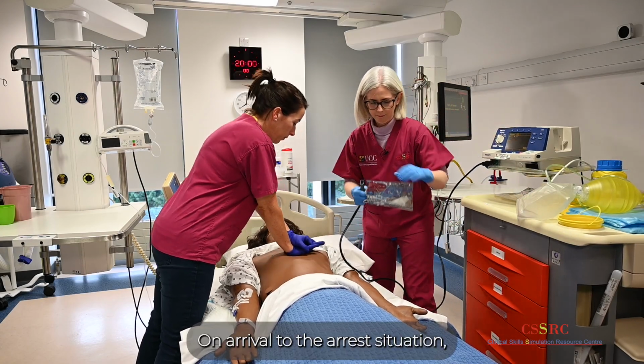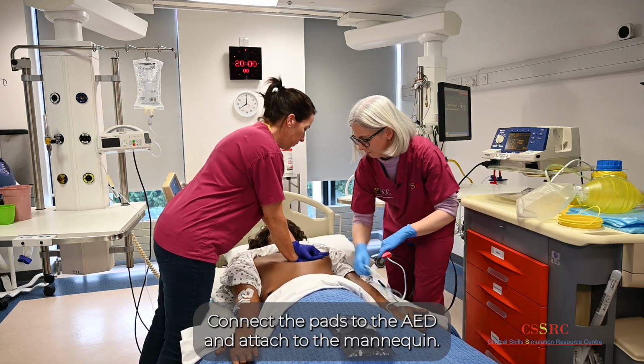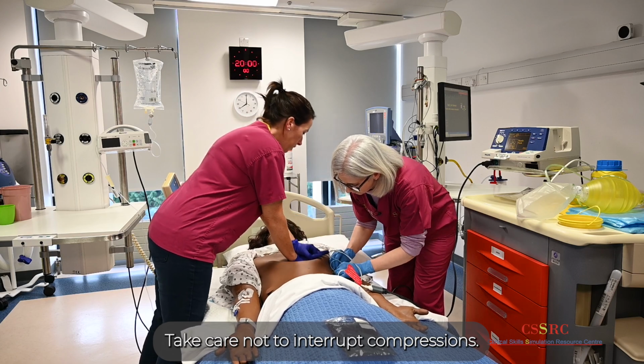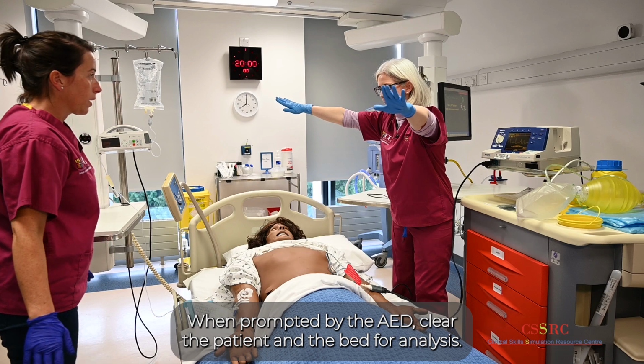On arrival to the arrest situation, firstly turn on the AED and follow the prompts. Connect the pads to the AED and attach to the mannequin. Take care not to interrupt compressions. When prompted by the AED, clear the patient and the bed for analysis.